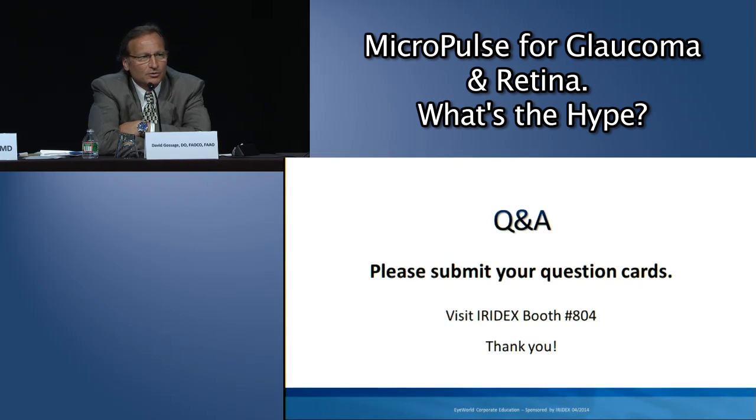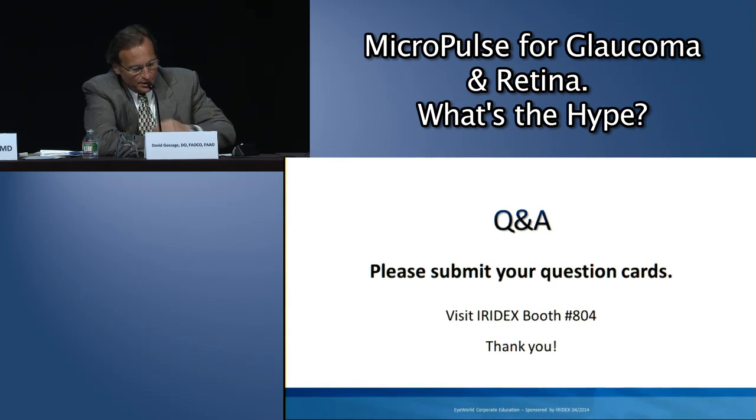I've used that before. I've treated patients over the fovea, and there's always a big question: can you treat over the fovea? And with the 5% duty cycle, I've seen no ill effects in 2.5 years of doing this. If you brought them back and did an autofluorescence or fluorescein angiography or an OCT, you're going to see no harmful effects as long as you're using the lower duty cycle.